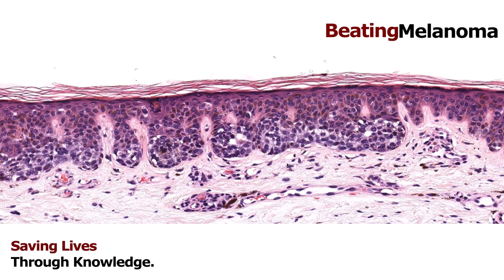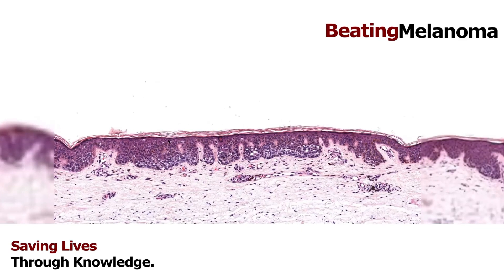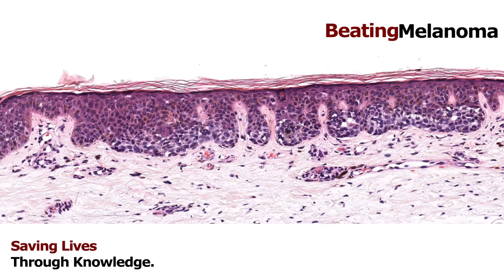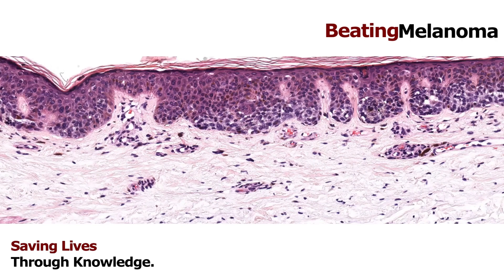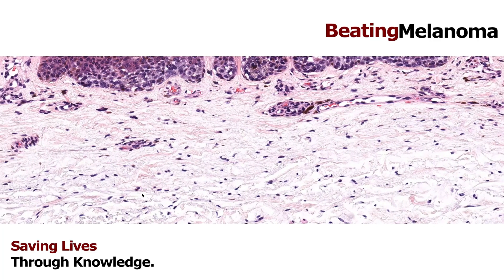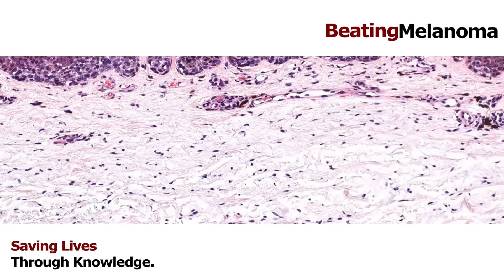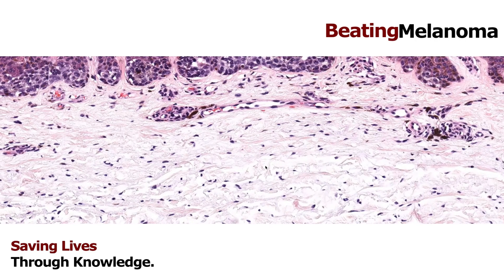At first glance this could look like a nevus — the cells are a little bit enlarged but they appear to be in nests. But with my training and the many cases I've seen, I was pretty sure this would be something worse than a nevus. One clue is the solar elastosis — that gray-colored dermis down here. Even without any history, I could tell this person is older and has had significant sun exposure over time.